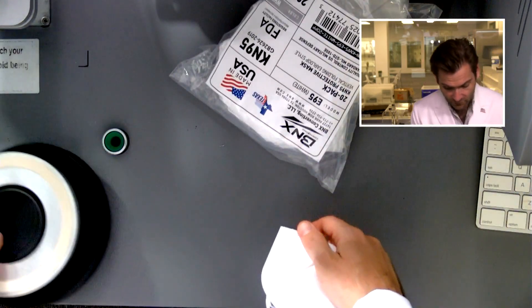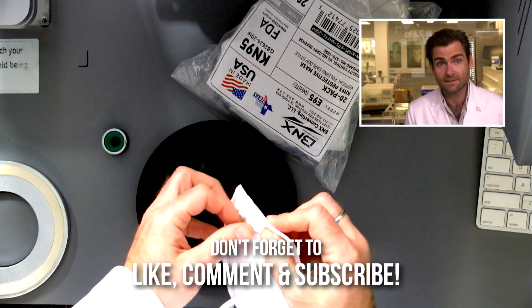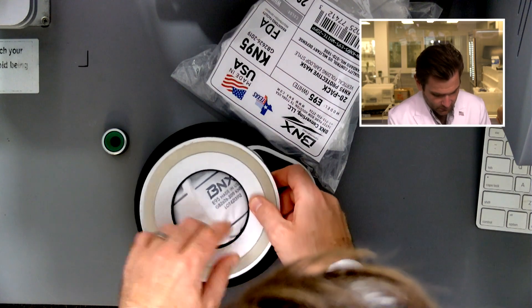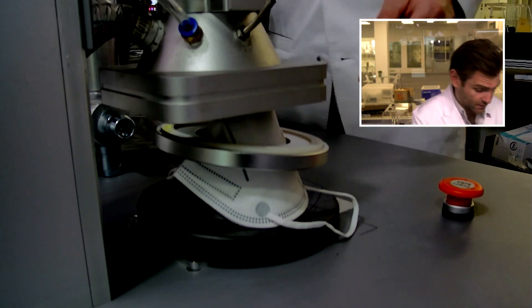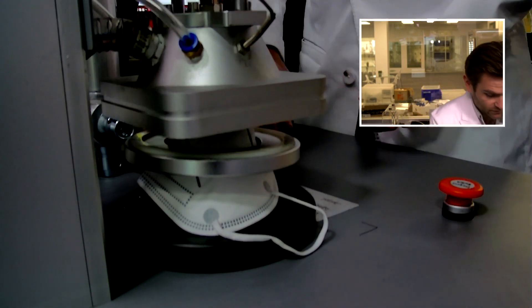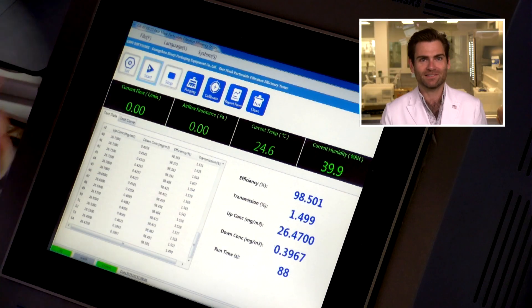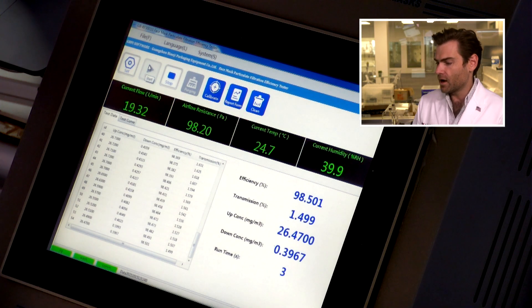I'm very excited — witnesses around me last night when I saw this come through heard me say 'oh my god, I think this is a real KN95 mask,' which you just don't find nowadays. Just kidding — it's a new standard.